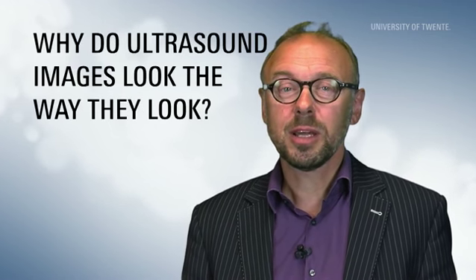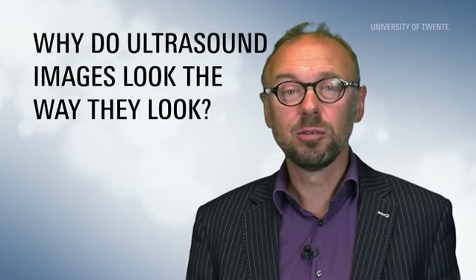You may already have seen many ultrasound images, these B-mode images showing many shades of grey. But what are we actually looking at? And why do ultrasound images look the way they look?